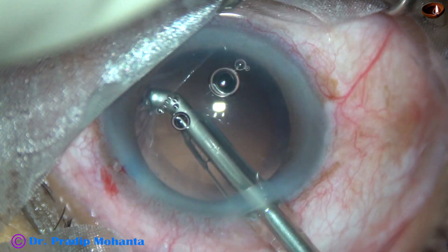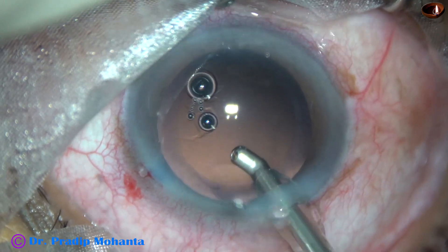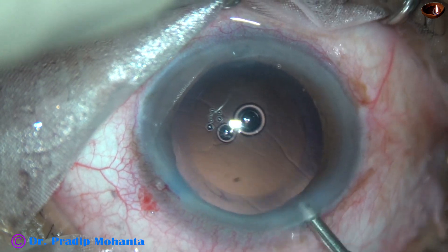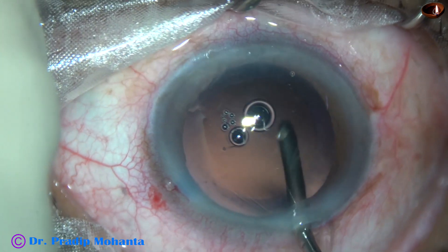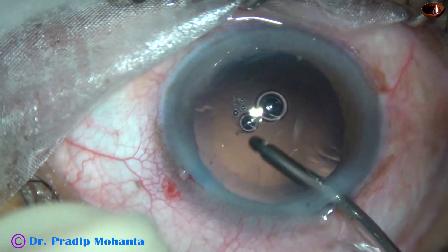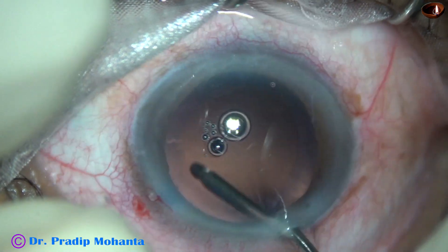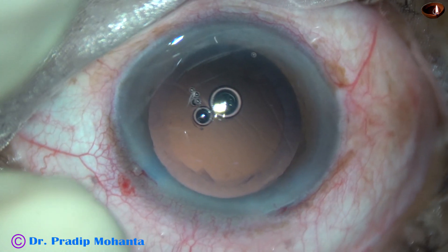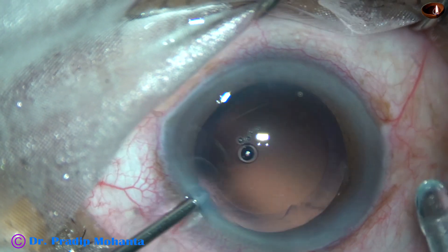This is the cortex from 4 o'clock. It is done. Polishing of the posterior capsule is done by the irrigating probe without aspiration. This is a good way of polishing the posterior capsule — you don't have any risk of PC tear during polishing.